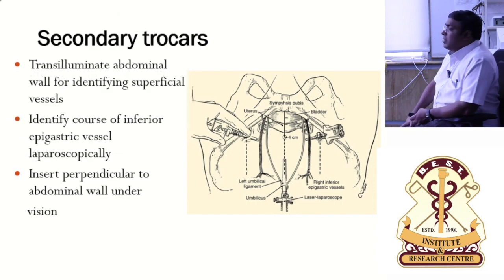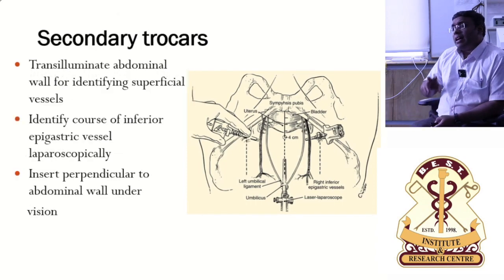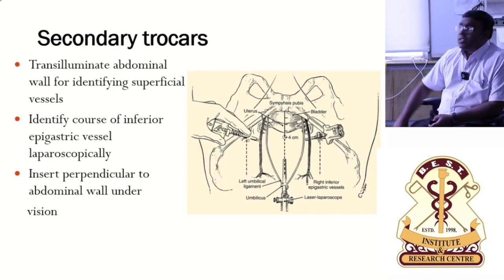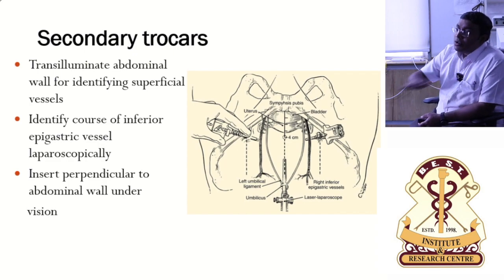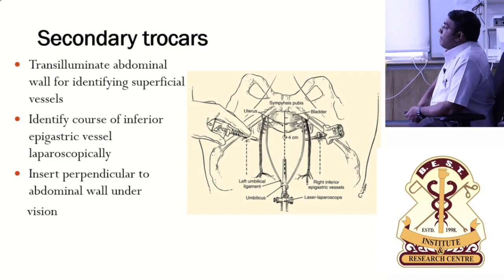But you should learn all the techniques. There are advantages of each technique. You should not say this technique is the best technique, whatever technique I follow. Whatever technique gives the best result in that case, you should do that technique. So you should know all the techniques of trocar entry.